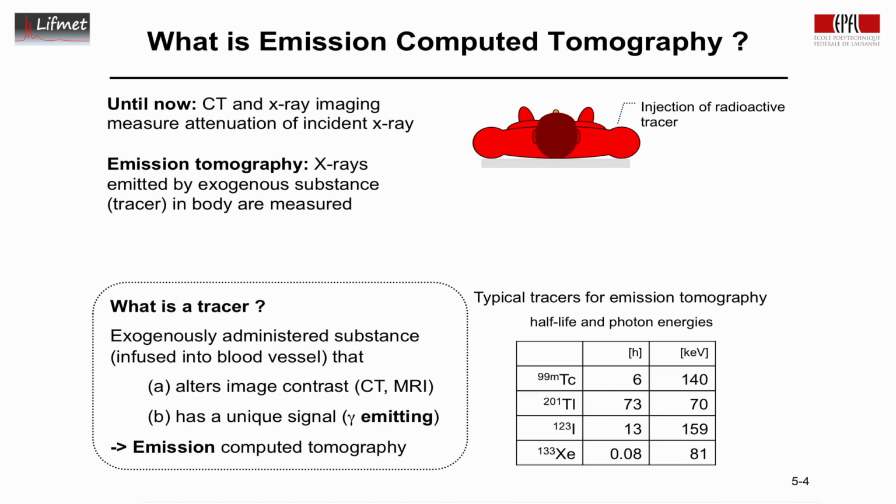Now imagine you have this tracer in your body. It is the result of a nuclear decay process. So this process, A, does not know anything about chemistry, and B, it doesn't know anything about directionality. So the X-rays that we see here, they are leaving in all sorts of directions, and that is not very useful for generating an image, and we'll have to deal with that fact.